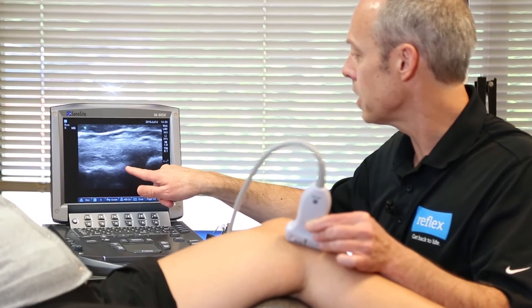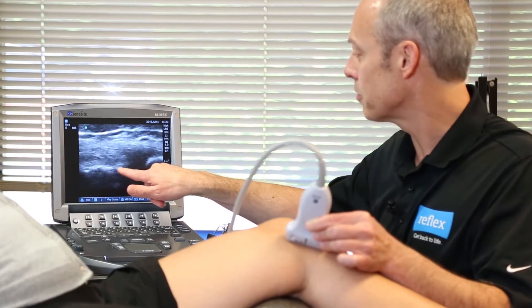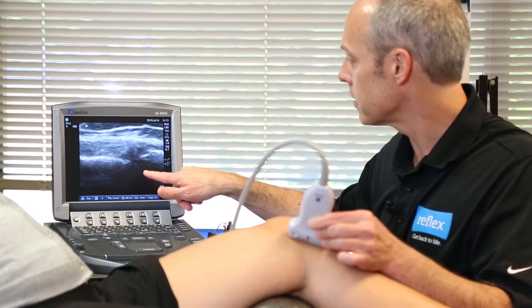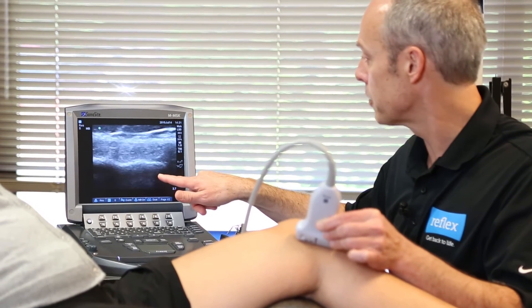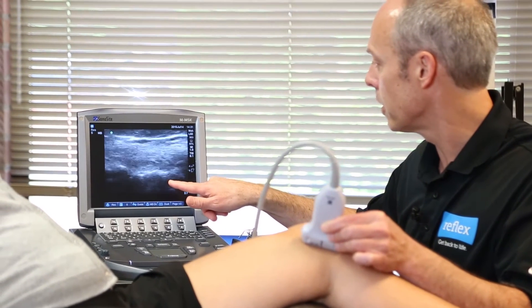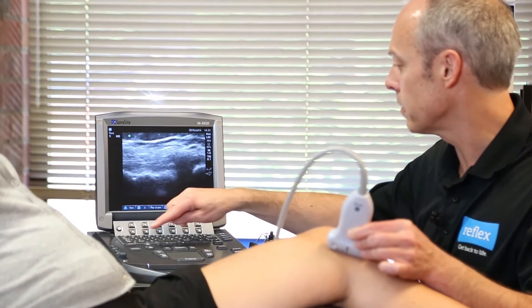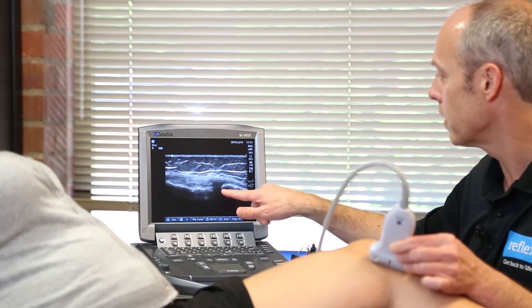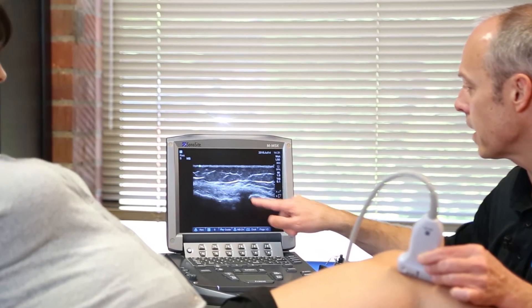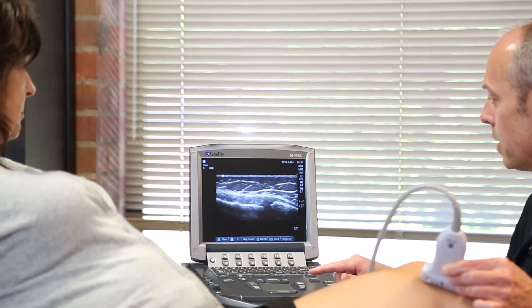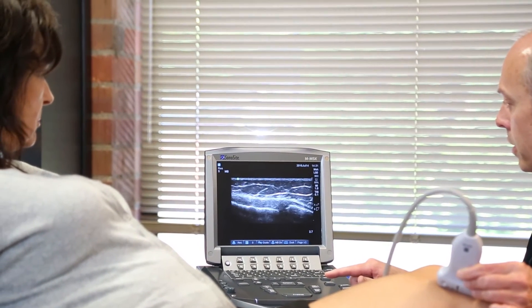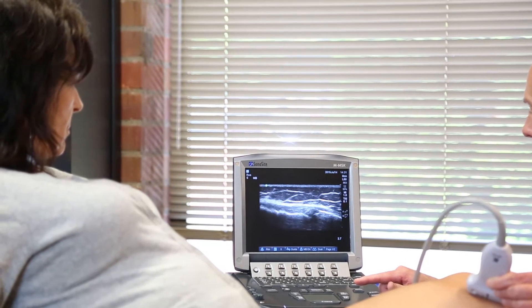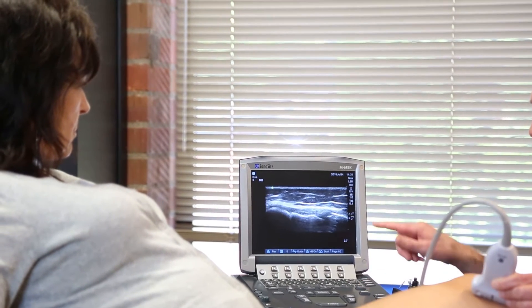What is unique about ultrasound as a diagnostic tool is that it provides a dynamic view of the joint. This allows our doctors to observe how the tendons and ligaments behave during motion and under stress, unlike x-ray or MRI which only provide a single static view.